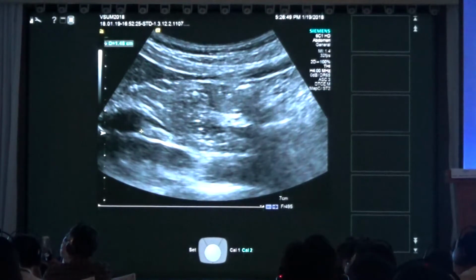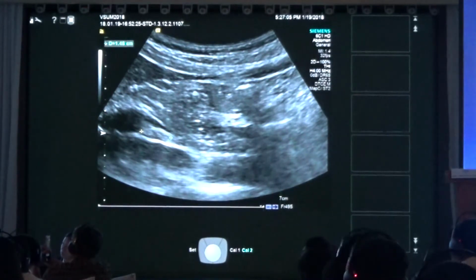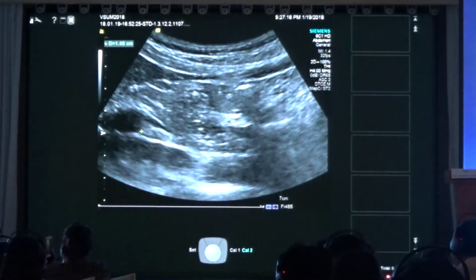Sometimes a little bit higher might give better results than lower. And then widen the arm enough, not too much, but enough. We have seen from 2 to 8 centimeters, we could have changed the window, a tip and trick in the daily routine. And then push the button like a monkey, and get your results. So that's what I wish to explain.